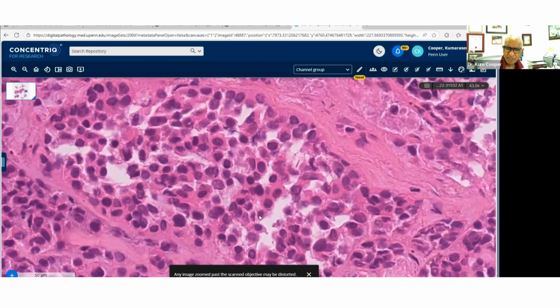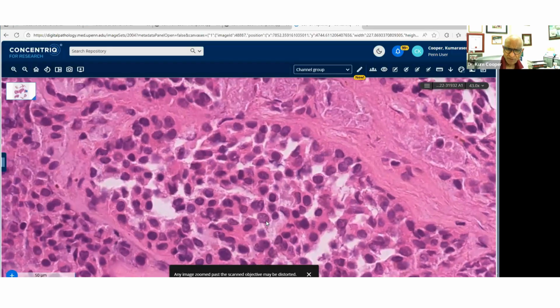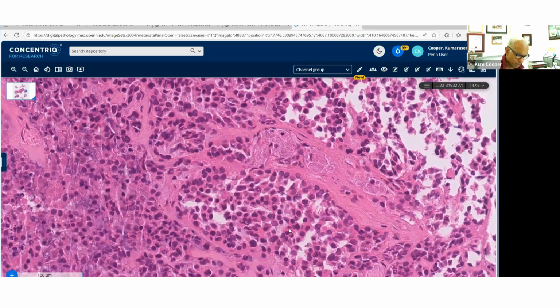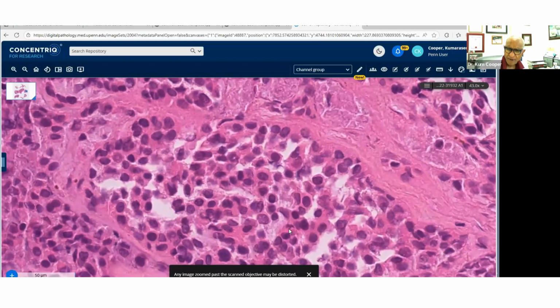That's my typical screening tool whilst I wait for the FISH analysis. But the cytoplasm is very pink here, so I would not expect this to be the classic Ewing sarcoma. But let's do the CD99. If you want to do the EWSR1 based on that, yes, we can do that. So we're doing the FISH for that.